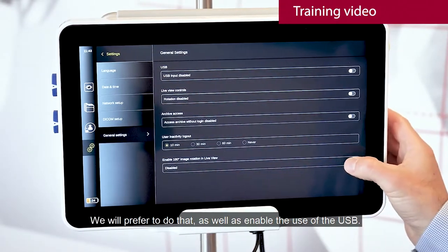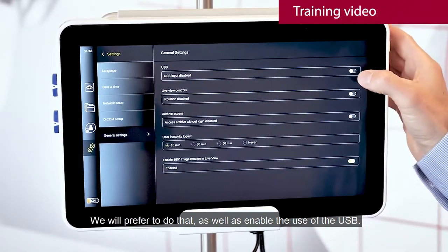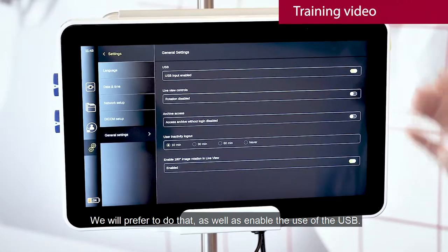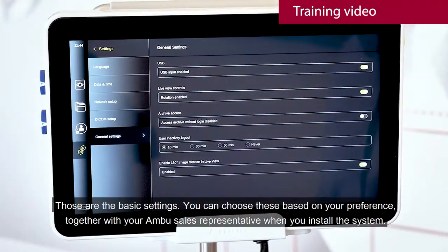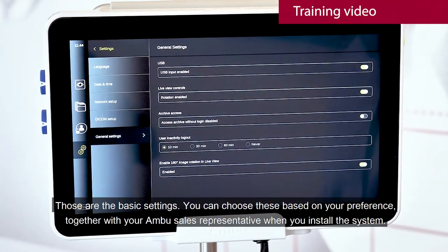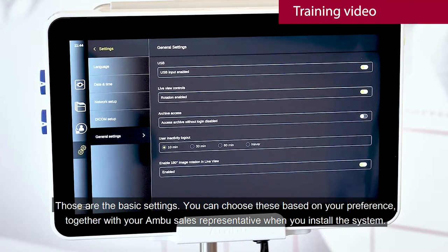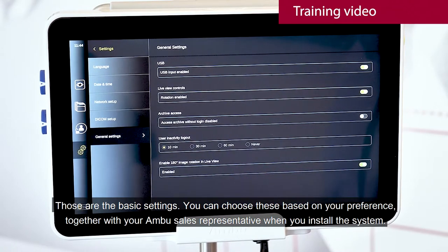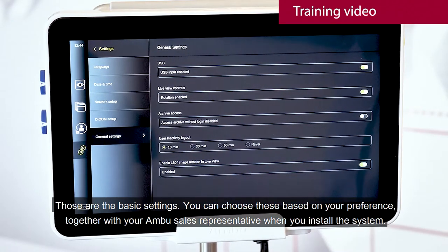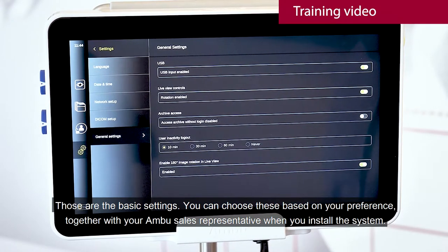We would prefer to do that, as well as enable the use of the USB. Those are the basic settings. You can choose these based on your preference together with your Ambu sales representative when you install the system.